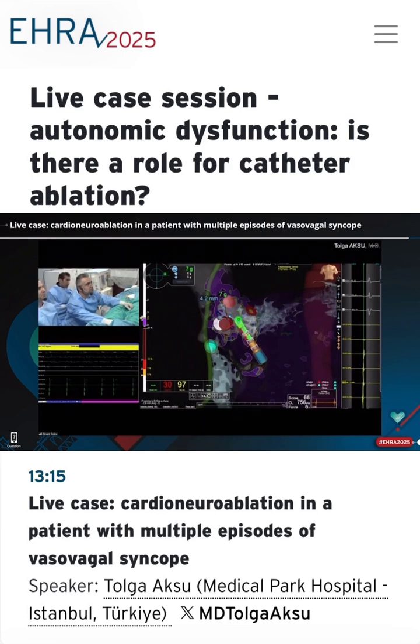I have one question. Do you only use radio frequency? Yes. You mean for cryo? Yes. During cryoballoon, based on the contact point of the right superior pulmonary vein and the superior vena cava, you can eliminate some of the right superior GP, some epicardial ganglion, but of course the best way is to use a 3D map.